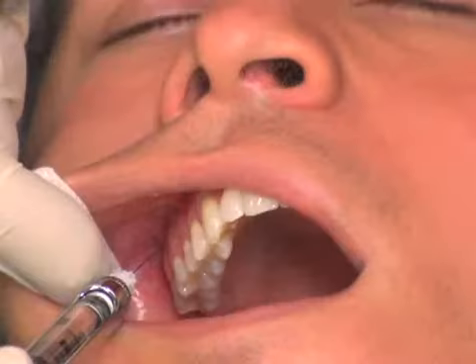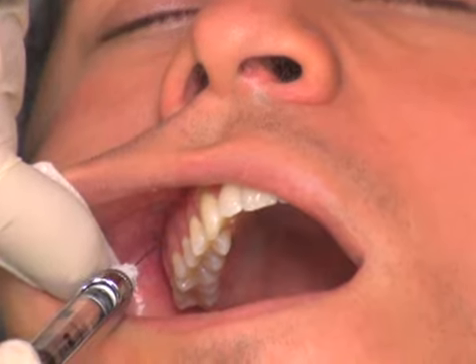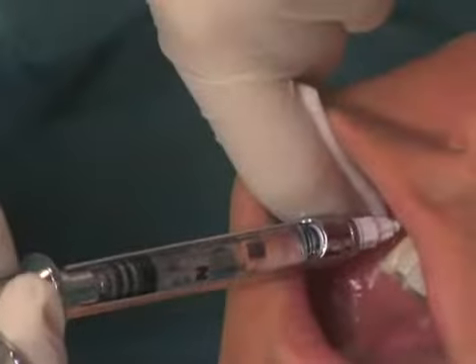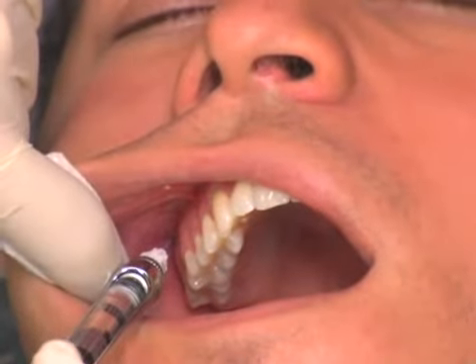The insertion site is the height of the buccal fold adjacent to the maxillary second molar. The syringe is held in an upwards, inwards, and backwards direction and is inserted to a depth of 16 millimeters. After 2 negative aspirations, a half a cartridge of local anesthetic is administered over 30 seconds.